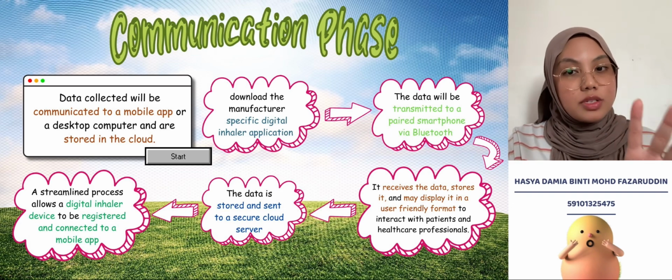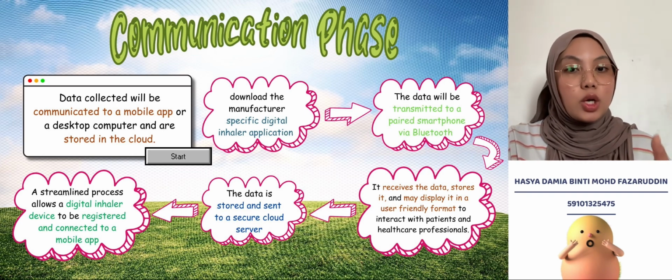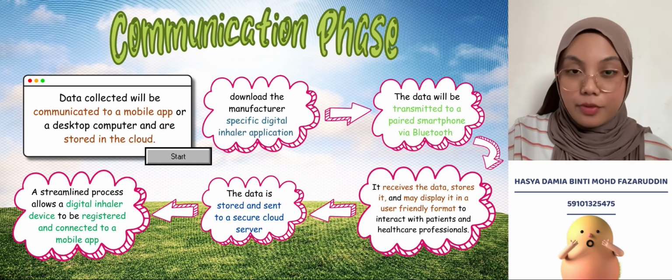Finally, a streamlined process ensures that the digital inhaler device can be registered and connected to the mobile app, making the whole communication flow smooth and efficient. And that's all for the communication phase. I will pass to the next phase.